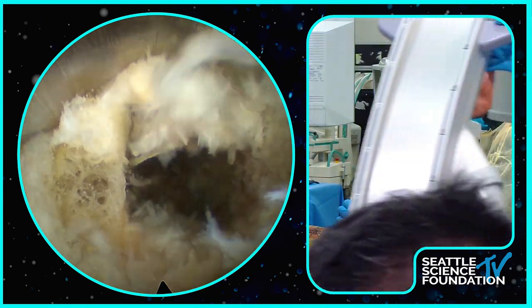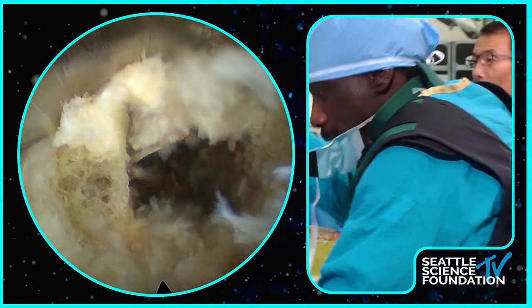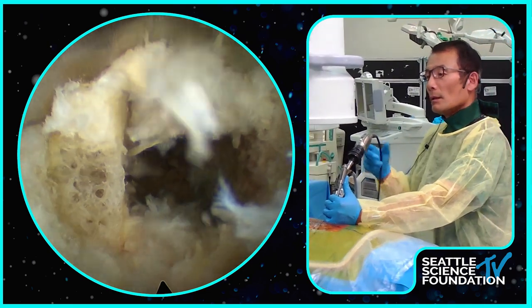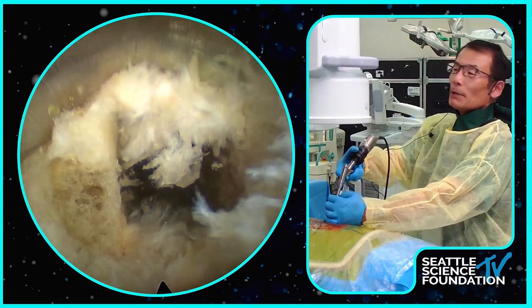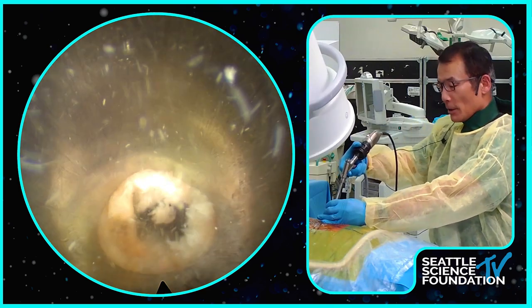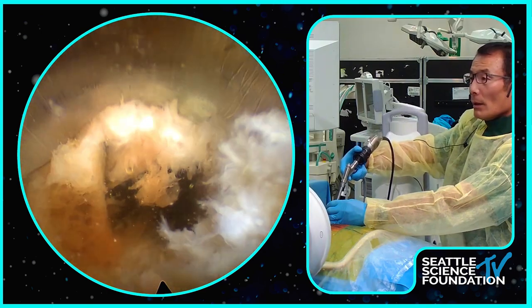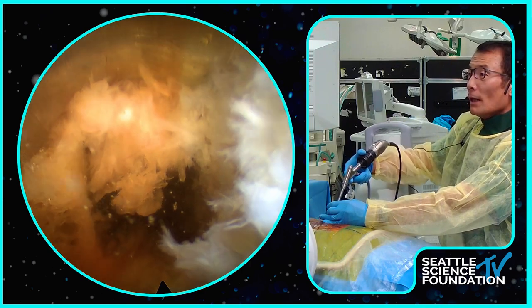You can come for lateral directly. So Shen, when you're putting this cage in, a lot of people say at this point you have to go on blind faith, or do you visualize the cage going in? What's your strategy for the cage insertion? No, for the monoportal, I can't. You can use a biportal to visualize the cage going in. Do you typically do that, or do you feel like you have enough protection from the ligamentum that you left there? Yes, because you can see that my bevel of my scope is.